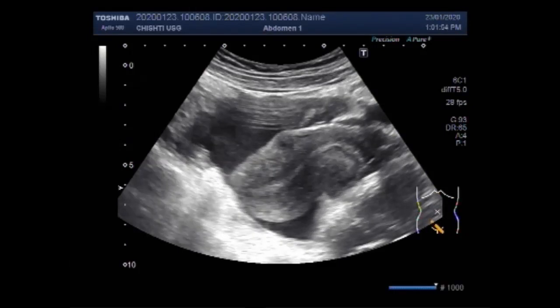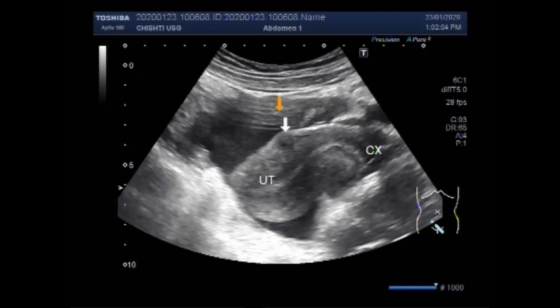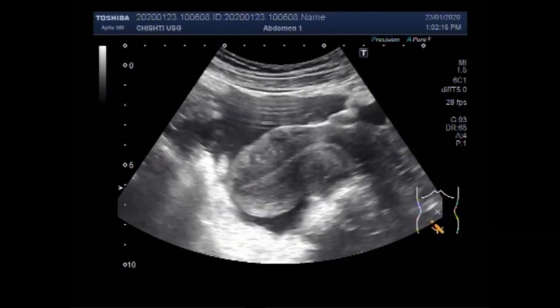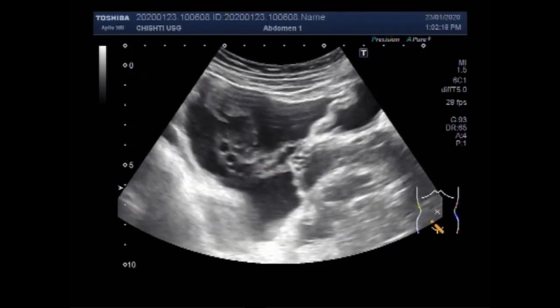Again you can see the thick fluid, the uterus, the cervix, and this small mass in the middle portion of the uterus near the anterior wall. These are the gut loops floating in the thick fluid seen in the lower abdominal cavity.